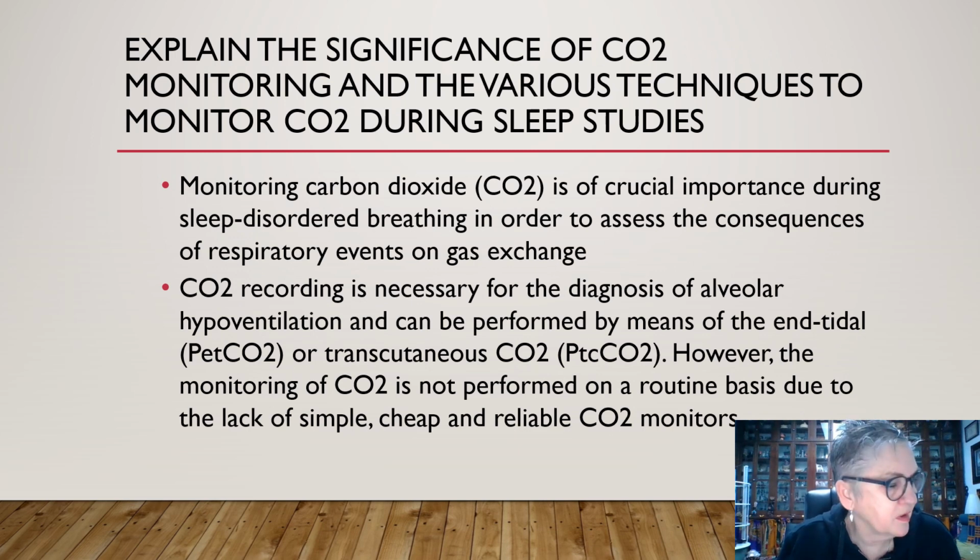Okay, we're going to go on to the next objective, explain the significance of CO2 monitoring and the various techniques to monitor CO2 during sleep studies. Monitoring carbon dioxide, CO2, is of crucial importance during sleep disordered breathing in order to assess the consequences of respiratory events on gas exchange.